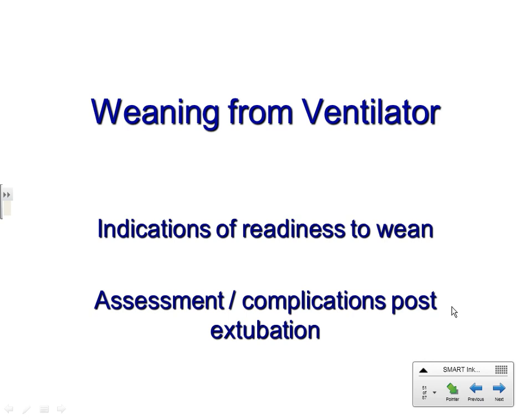So that is it for ventilators. That's what you need to know about them. What do you as the nurse need to do for that patient? What do you assess? What are the complications? Don't worry about doing the settings. The respiratory therapist is going to take care of that. You just want to check that patient's pulse ox, make sure that they're well oxygenated, make sure that physiologically they're doing great. So feeling a little bit more comfortable about vents now?